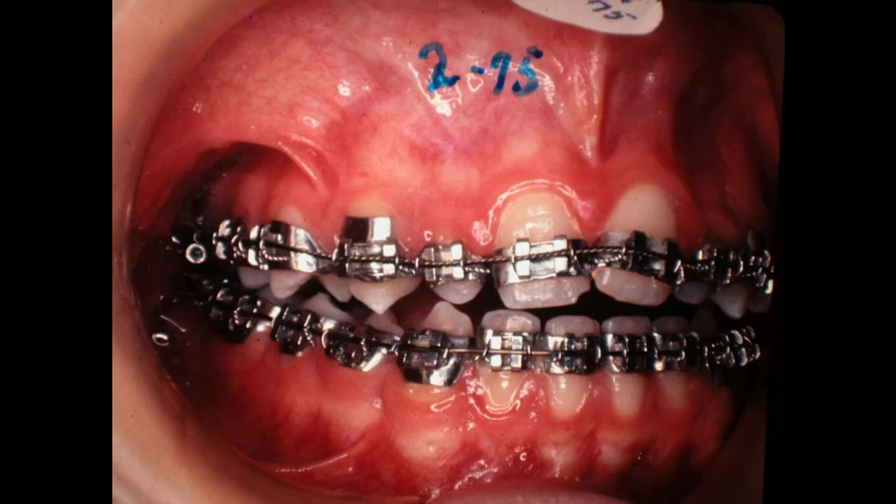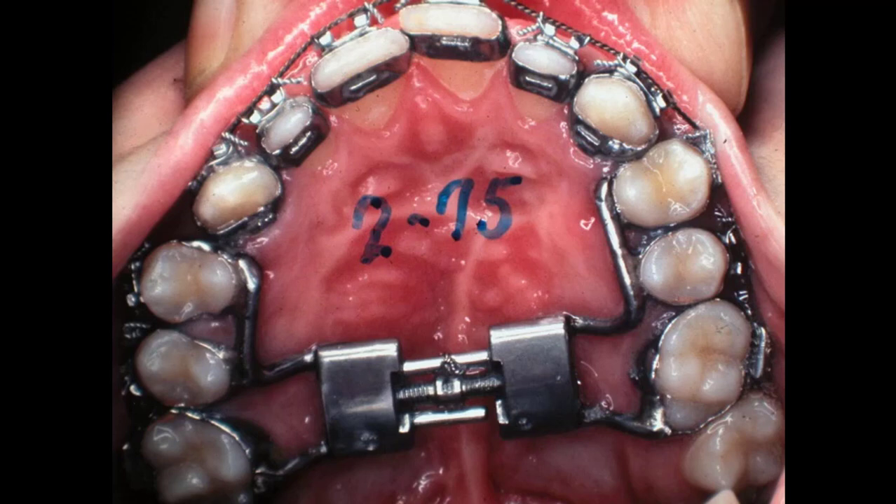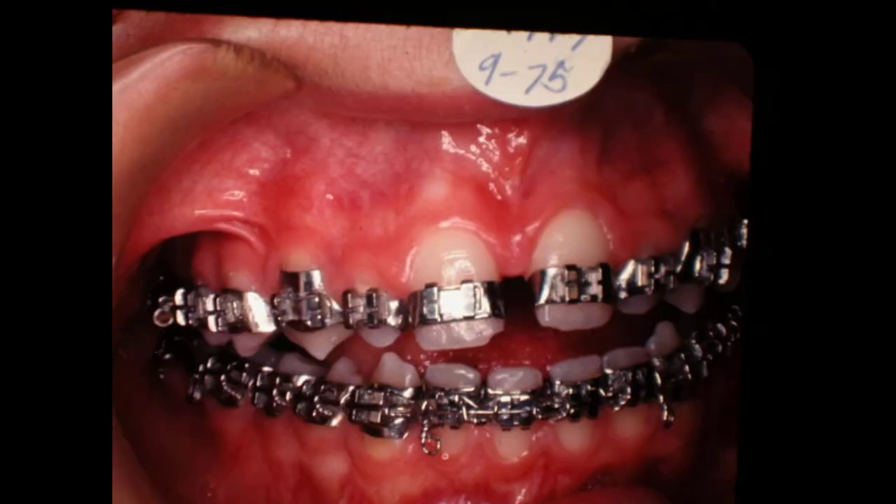I'm going to show several cases where we've separated the palate like this. Now this is the one that had completely come apart in here, so we put another one and used it. We didn't go too much further with it. And the lower arch is spread out. That's 9 of 75.